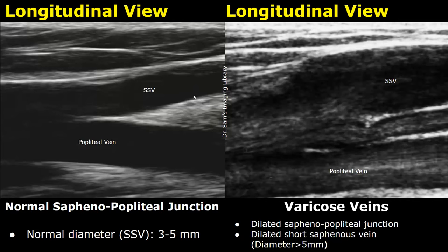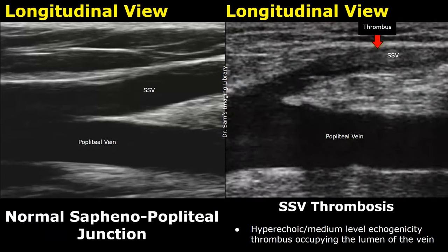In the case of varicose veins, the saphenopopliteal junction may be dilated, and the short saphenous vein can also be dilated. Here is a case of short saphenous vein thrombosis. A thrombosis will be seen as a hyperechoic or medium-level echogenicity structure occupying the lumen of the vein.